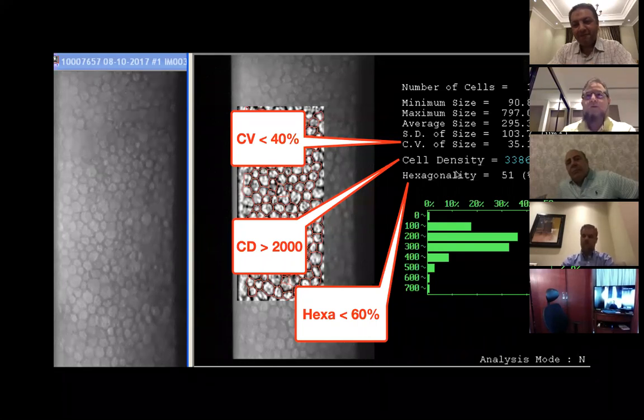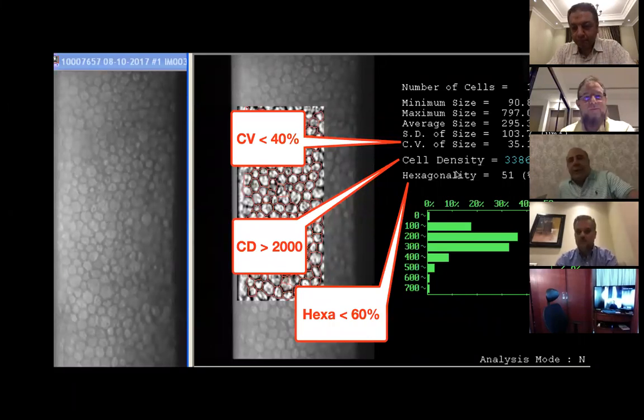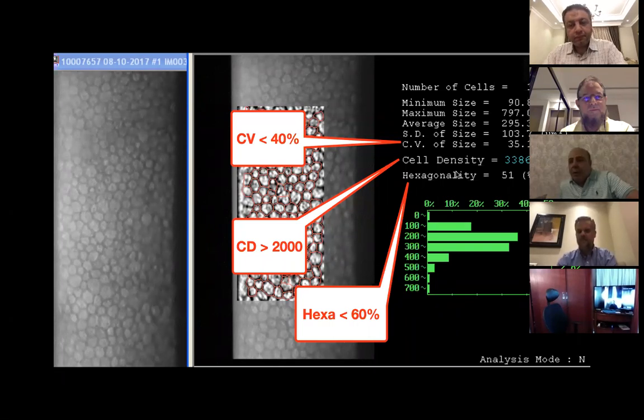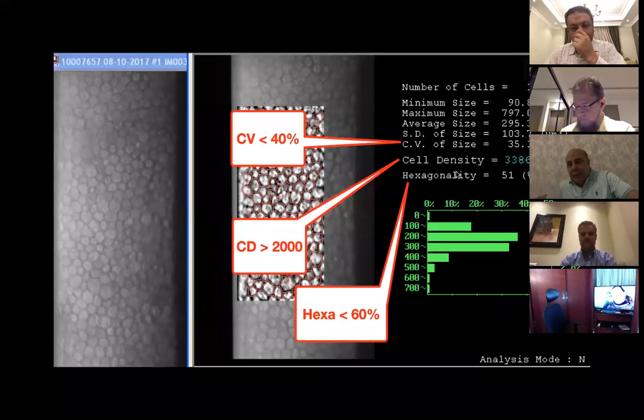Great. May I ask Dr. Mazen, Dr. Yasser, did you ever remove an ICL for a problem in the specular microscopy, or I mean in the endothelium? For me, I've been implanting ICL for a long time, and still I didn't remove a single case for this reason. There is no problem with the endothelium, or no significant effect on the endothelium.